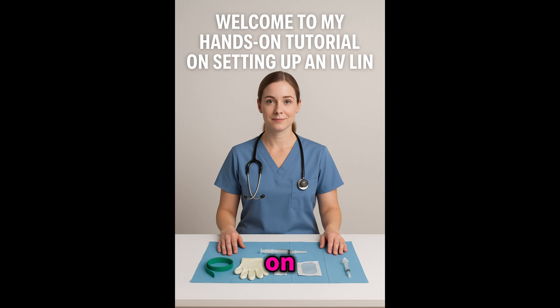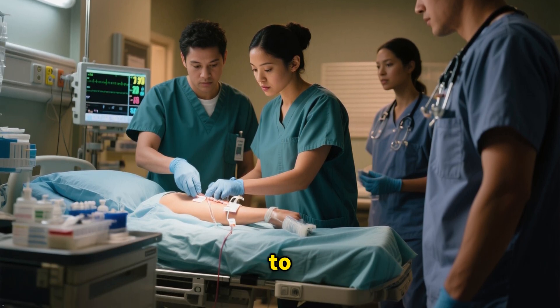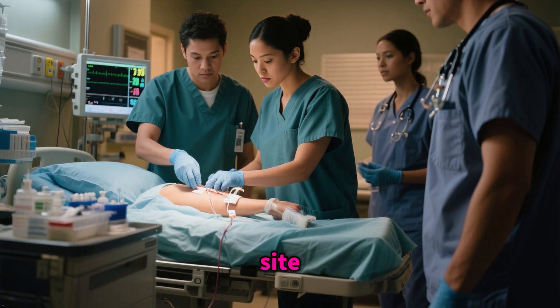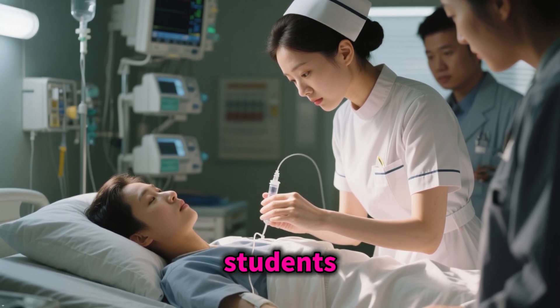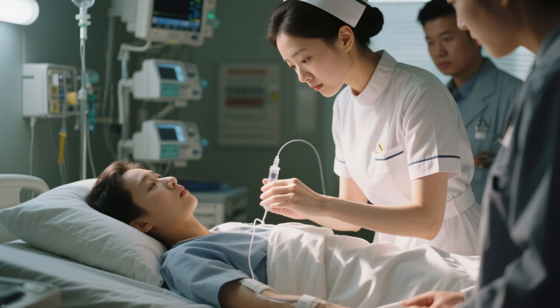Welcome to my hands-on tutorial on setting up an intravenous line. In this training, I'll walk you through every step from gathering supplies to securing and monitoring the site. This is perfect for nursing students, clinical staff, or anyone who wants to refresh their IV skills. Let's get started.